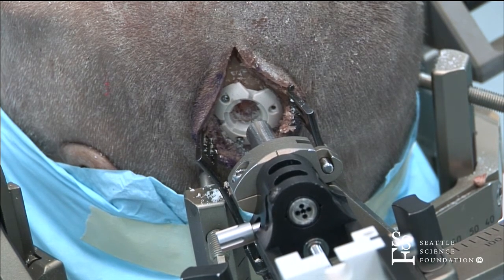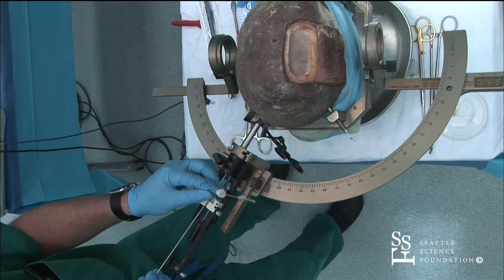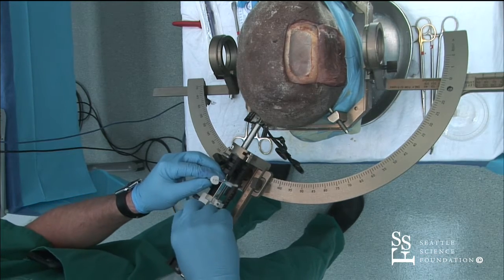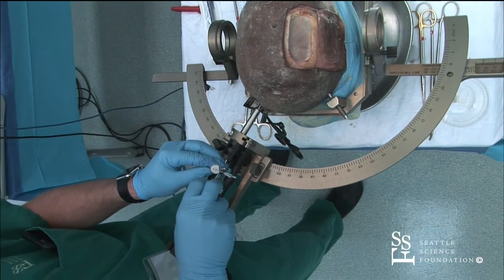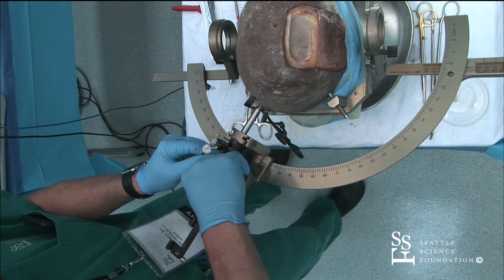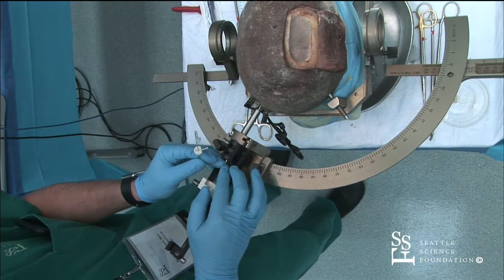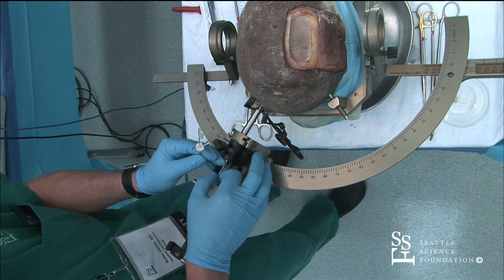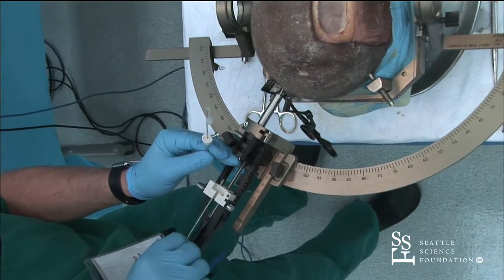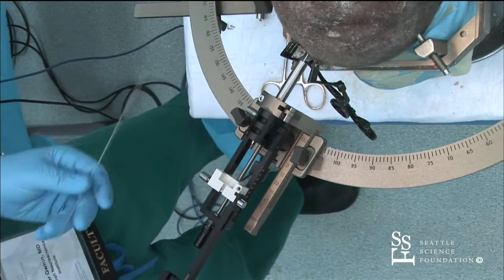All right, sorry. So we'll put our cannula in first. That's the slotted cannula, which would be for the shorter electrode. So again, this is the method for the longer electrode. There is a method where you can use a shorter electrode, the 30 centimeter, but we have to then use a slotted cannula for that.